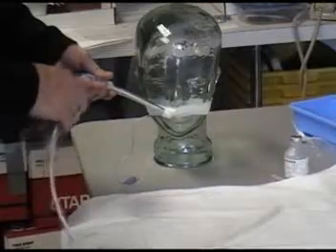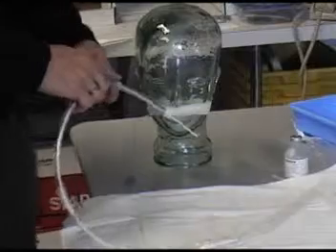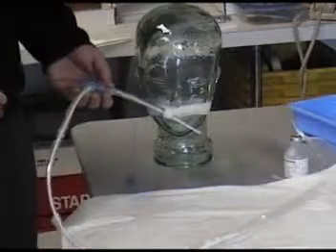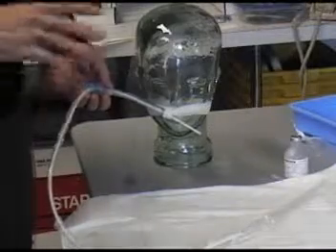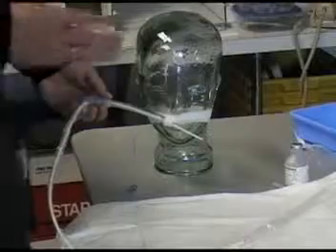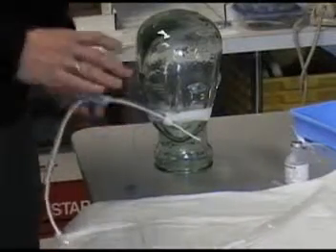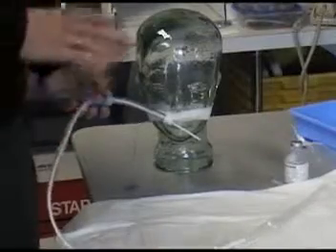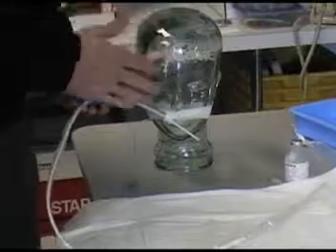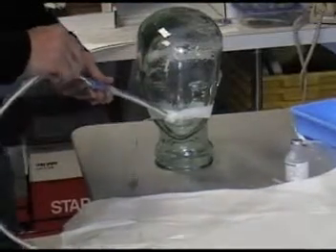As I funnel this down, you can see me pulling back the sheath. The Combicath is a feel procedure. As soon as you meet resistance, you stop. If you think you're at the carina, you should stop. If you think you're in the lower lung, you could stop. It's for this reason you won't find any markings on the catheter. The company feels that if you meet resistance, the most important thing is to stop and assess where you are. If you think you're in the lower lung, then you move on with the rest of your procedure. If you get the feeling that you're at the carina, what you would do is pull back and then try to go back down again.